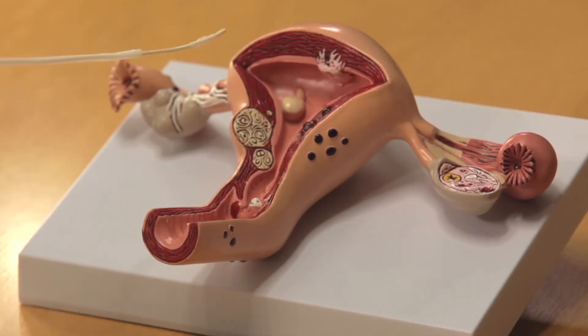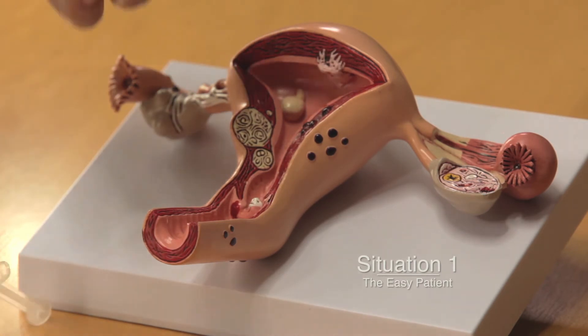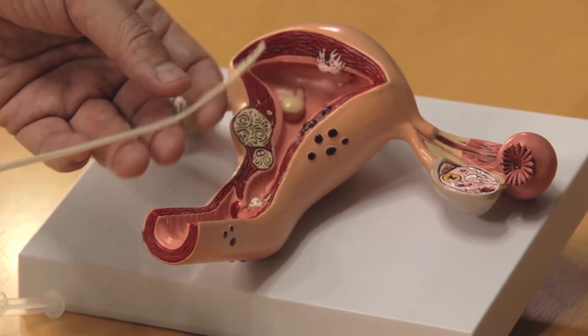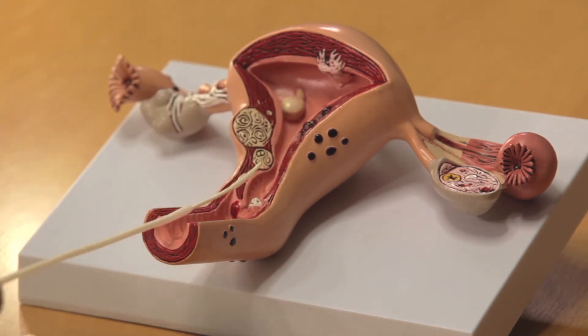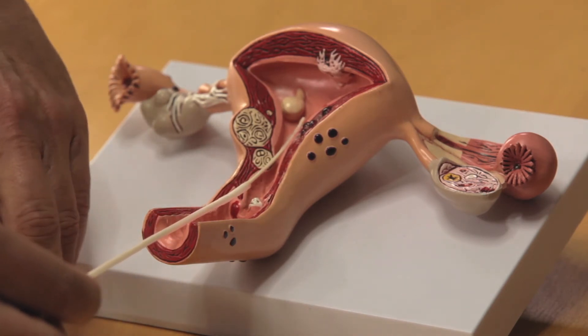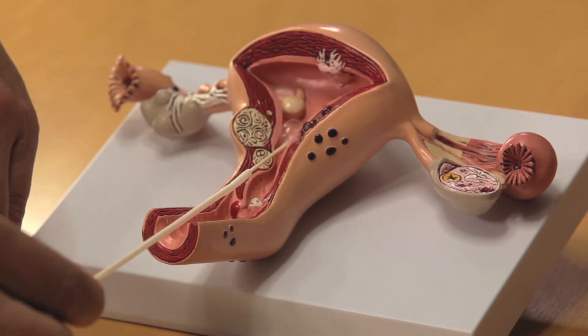Placement of the Miller Advanced Catheter is quite easy. I'm going to show you three patient profiles where we can place the catheter without any problem. Let's first talk about the easy patient. Simply draw the sheath back — you have the soft catheter, no discomfort. Bring it into the endocervix, lower uterine segment, and inflate the balloon.